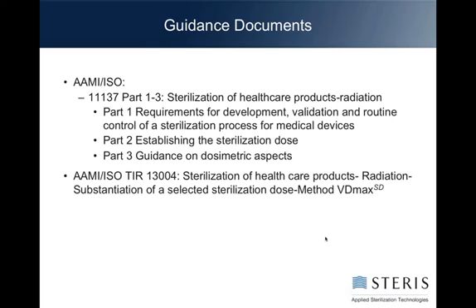Part 2 is the one where we're going to spend most of our time today, and that is literally the step-by-step parts of setting a sterilization dose. Part 3 will become much more important to you in the seminar next week on dose mapping. This is where you'll get your guidance on measurement of dose and distribution of dose throughout a product.